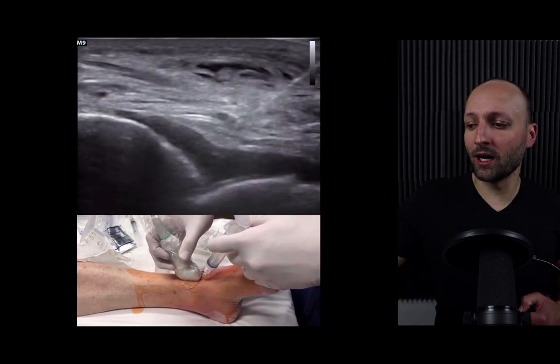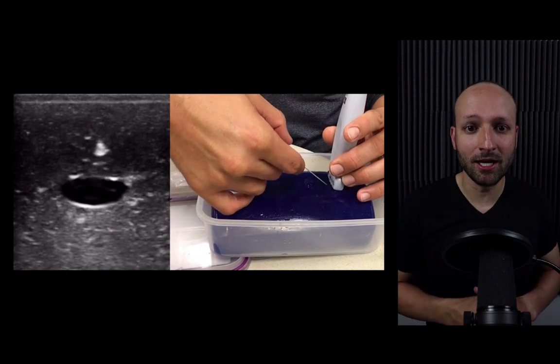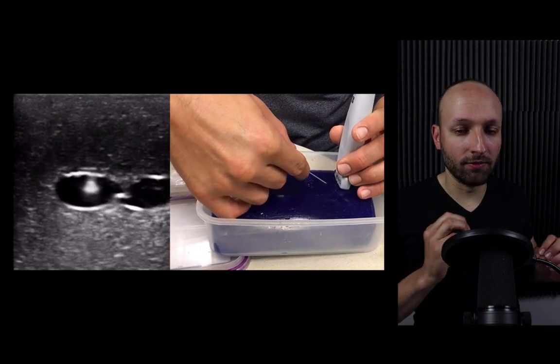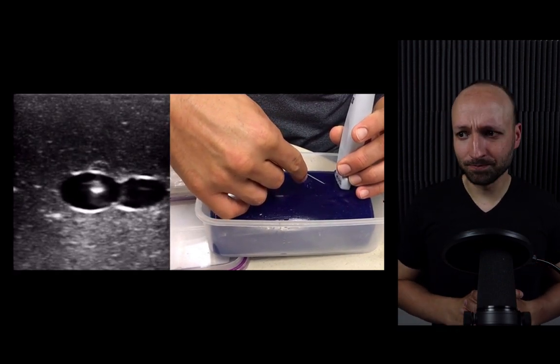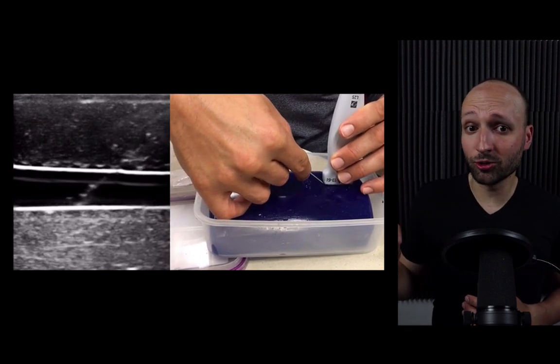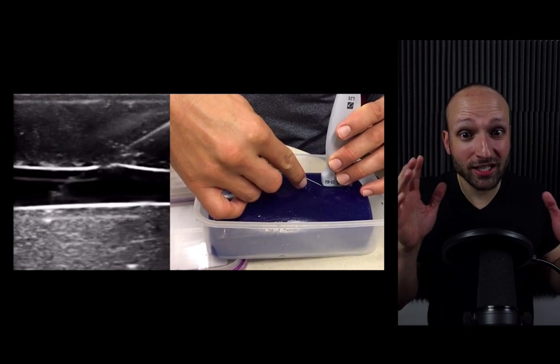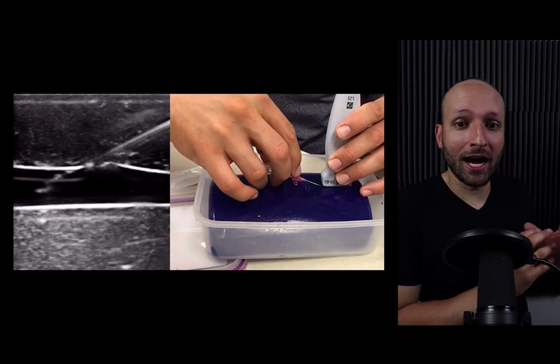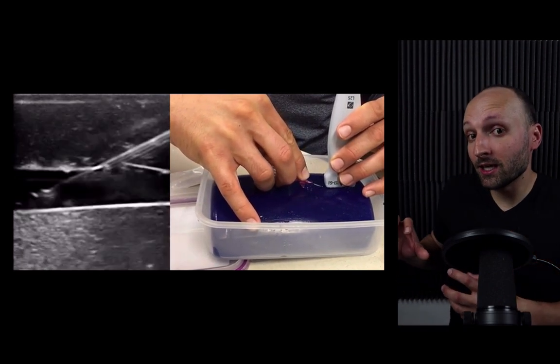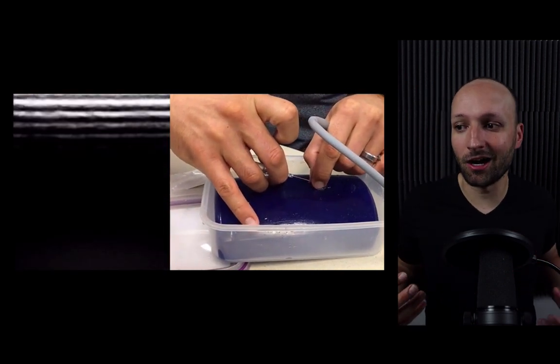A good place to start anytime that you're thinking about techniques is to start with ultrasound guided IVs. I am very strongly in favor of us doing ultrasound guided IVs. This is, in my opinion, the most difficult ultrasound guided procedure that exists and also the least risky, which is actually good. So if you get really good at a very difficult technique that's low risk, the easier techniques that are higher risk are going to be much easier for you and you're much less likely to cause harm.